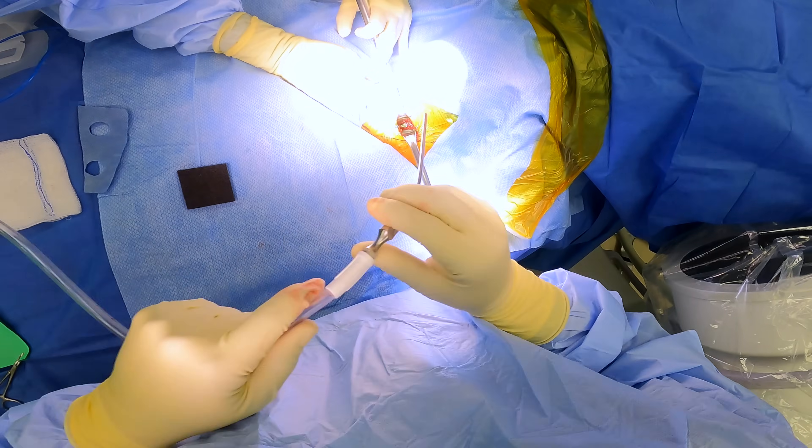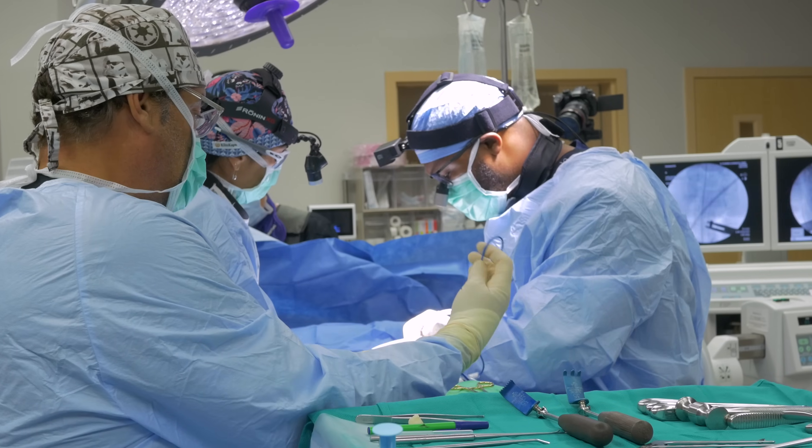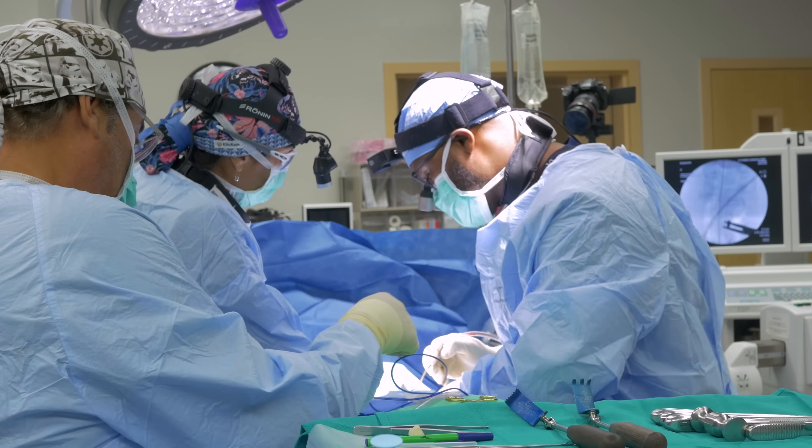Okay, we can also look at it and take a look. Let's see where the midline is. I think it's a little bit toward me — that's what it looks like when I look in here.